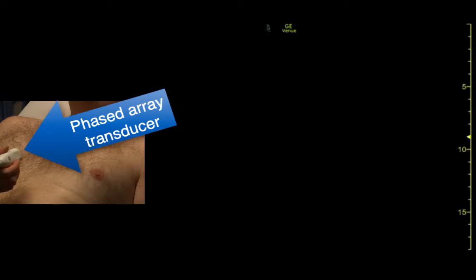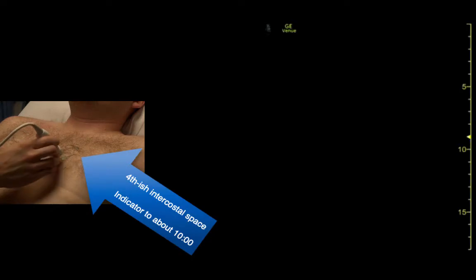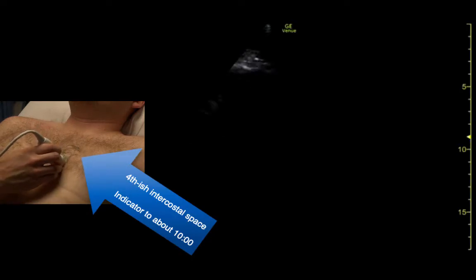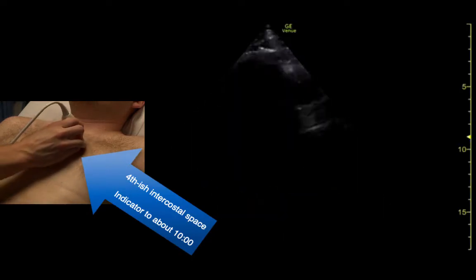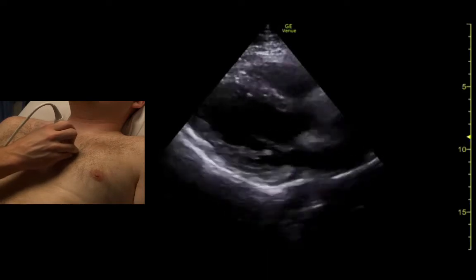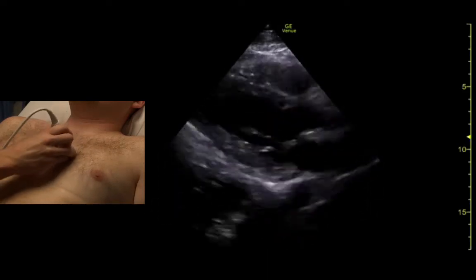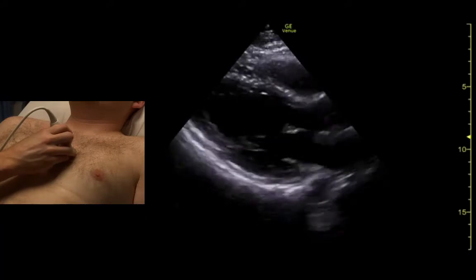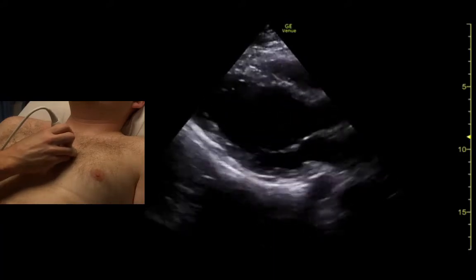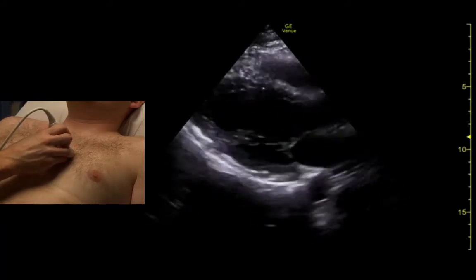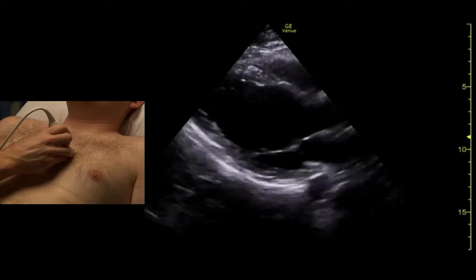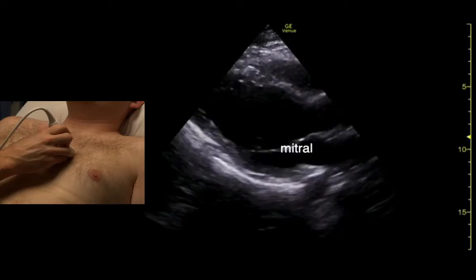The indicator is to the patient's right, somewhere between 9 and 10. We start next to the sternum and go up and down until we start to see something that looks like heart, and then when we see something, we do little tiny movements to try to perfect it. It's a good view when we can see the mitral valve and the aortic root, and as much of the length of the left ventricle as we can get.